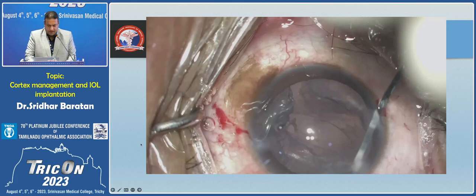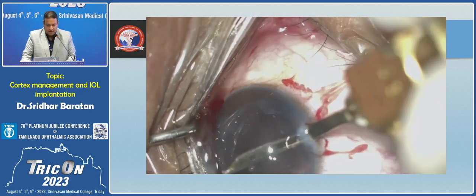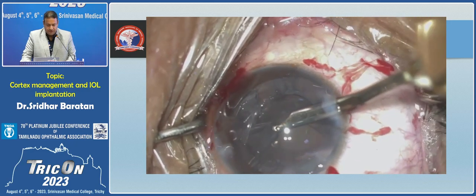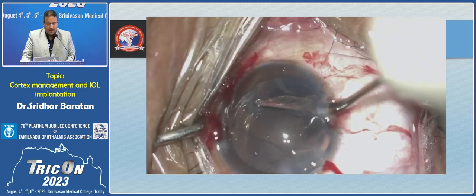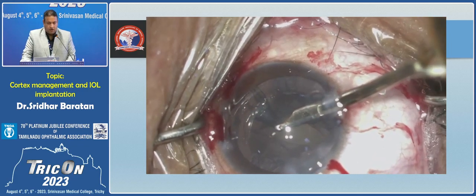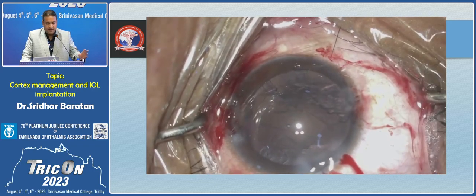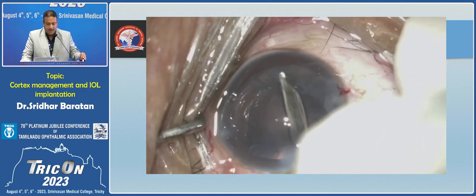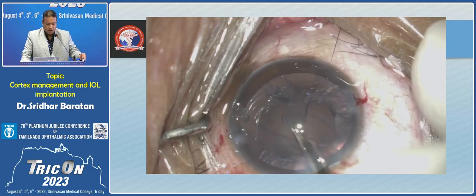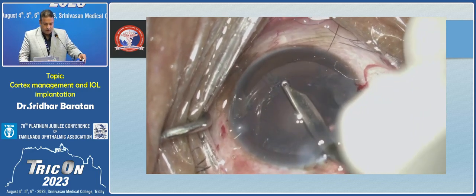Now, this is going to be a difficult case because if you notice, there's been a PC rent that has happened, and this is where you use your dry aspiration. The trick here is to make sure that the chamber is adequately maintained, and when you are coming out, always remember, do not panic. Make sure that you remove the phaco tip first and then keep the irrigation properly maintained, and then you can gently tease the remaining cortex without disturbing the anterior hyaloid face, and this case goes on pretty smoothly.